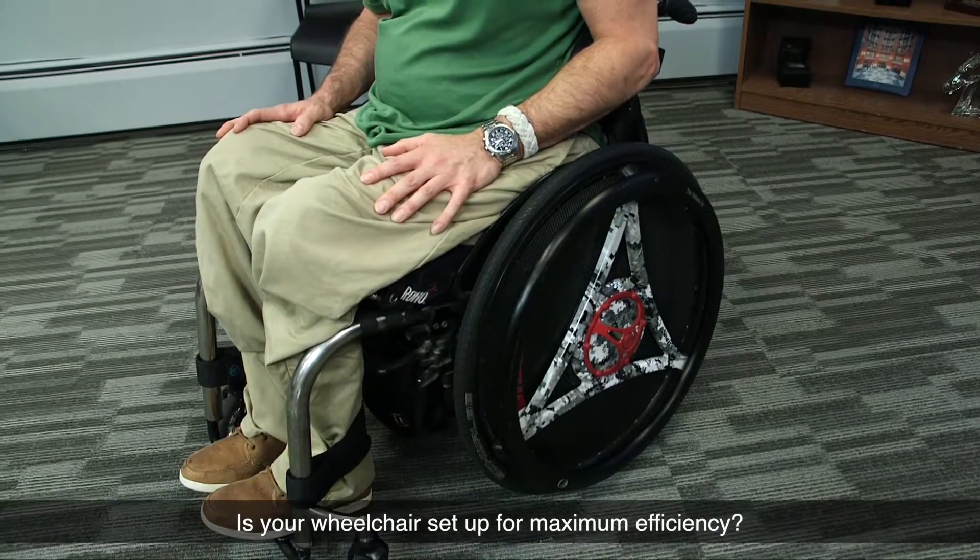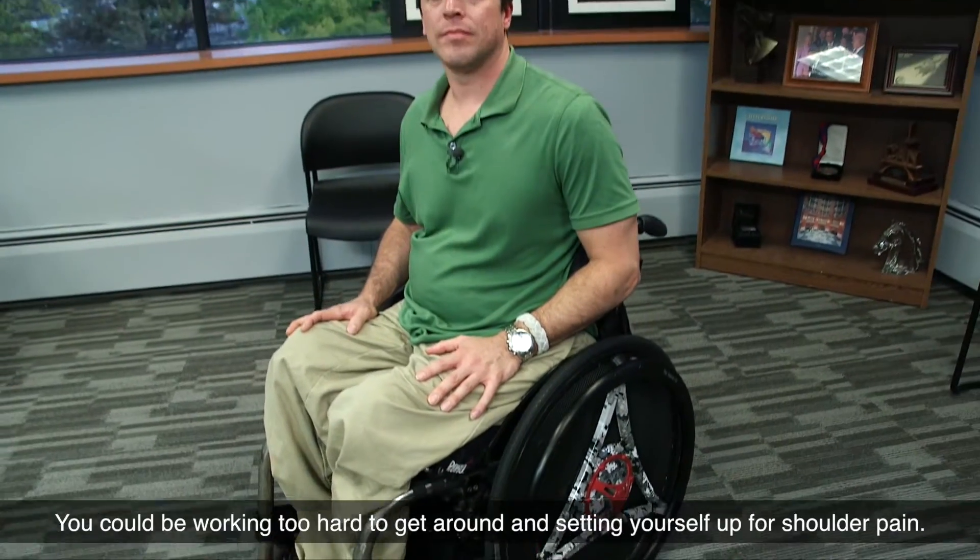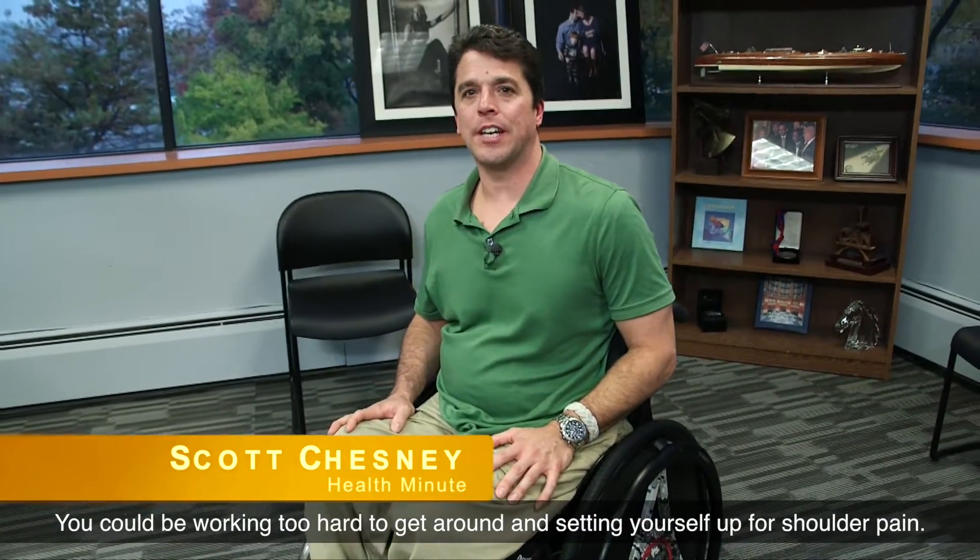Is your wheelchair set up for maximum efficiency? You could be working too hard to get around and setting yourself up for shoulder pain.